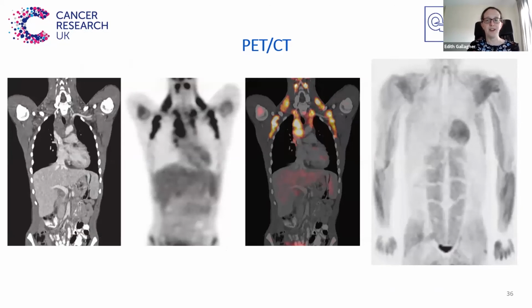It is worth mentioning that not all areas where there is an increase in radiopharmaceutical on images is a bad sign. Depending on the properties of particular radiopharmaceuticals, they may naturally show in the heart, the brain, the liver, digestive system, or urinary system, as well as any cancerous areas.